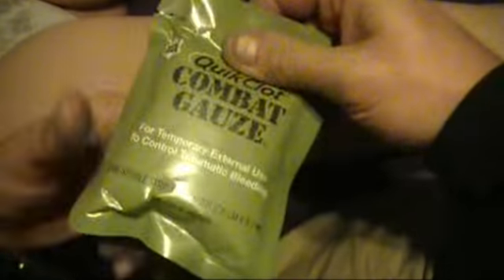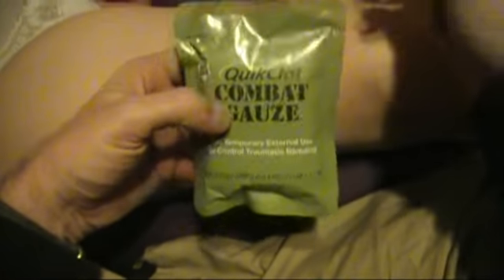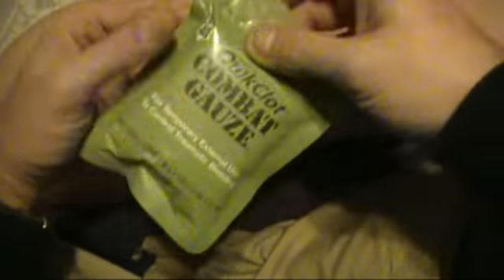Now, I'm not going to get into all the powdery stuff, because the powdery stuff actually takes more skill. Remember, you've got a lot of blood gushing out of here. When you dump powder into it, the blood is going to push the powder out. So you have to learn a little bit of technique in order to stop the blood. With stuff like this, or Hemcon dressing, or a bunch of other products, we'll stick with the combat gauze because it's pretty much an industry standard. What it is, looks like gauze. Well, looks like toilet paper. But it is treated with an agent that promotes clotting and stopping bleeding.